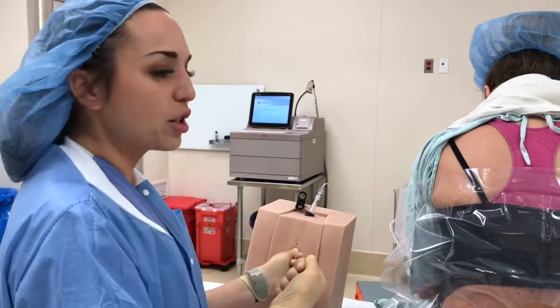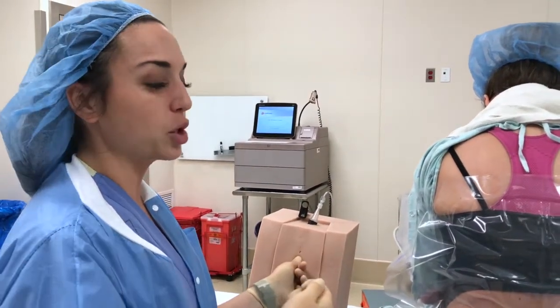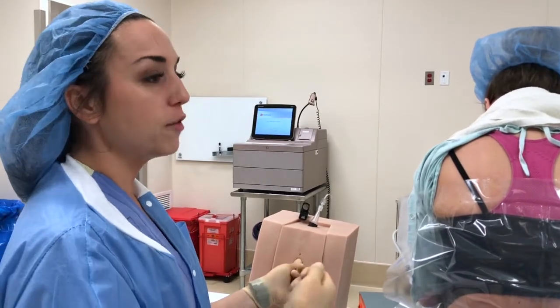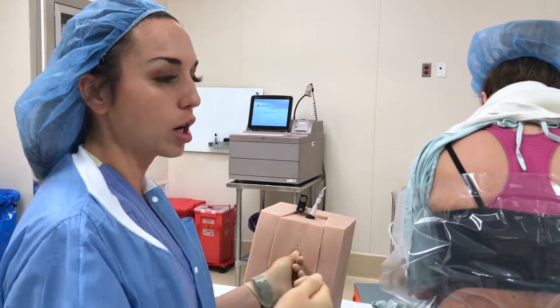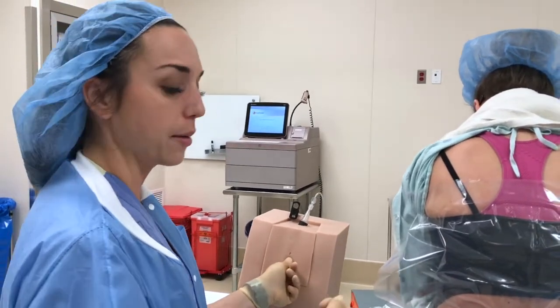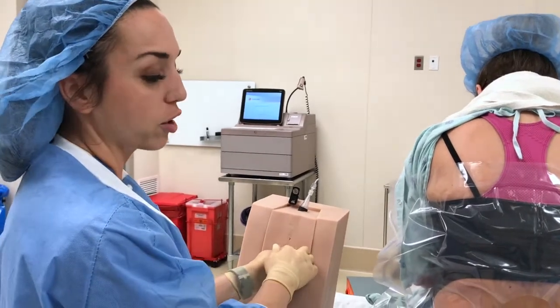Interspinous ligament feels many times very bristly or like bristle. Many times you can hear it crackle. For many women, it'll feel nice and tight. It'll be the first time that you'll encounter a decent amount of resistance. Okay, and I'll talk about that in a second when I introduce the Tuohy.